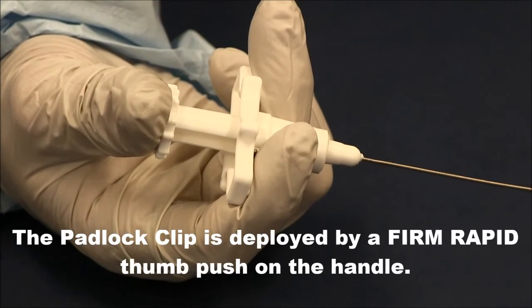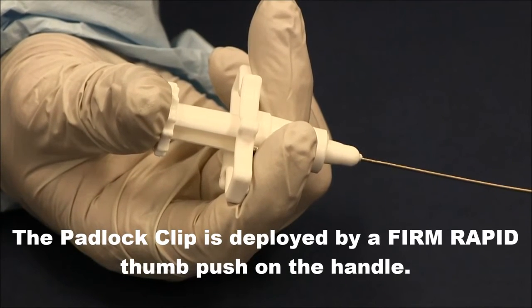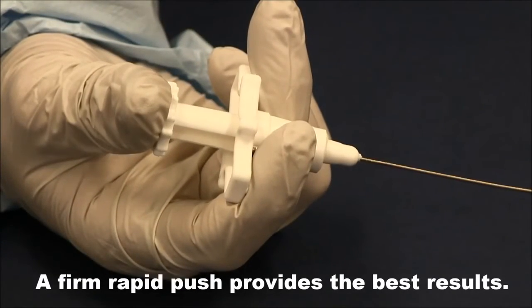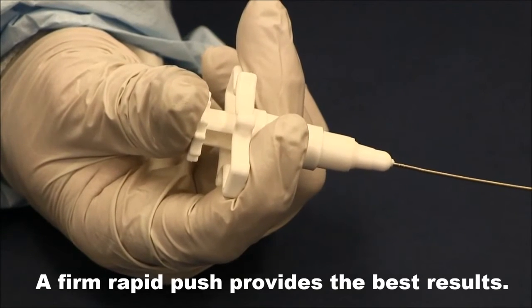The padlock clip is deployed by a firm, rapid thumb push on the handle. A firm, rapid push provides the best results.